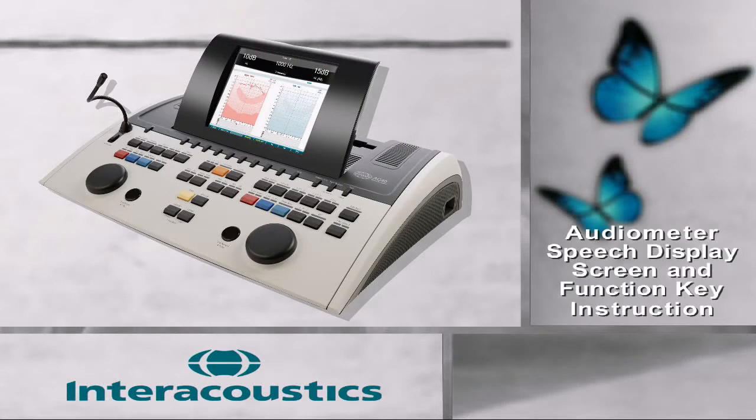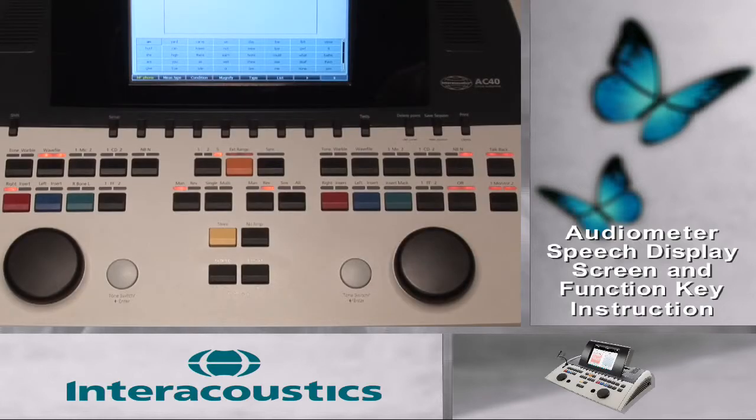The speech screen provides visualization of the audiometer settings and testing results while conducting speech audiometry. This video series will explain the use of the function keys that line the bottom of the screen. The audiometer keyboard button overview can be viewed in a separate video series. Return to the video tutorial series for selection.